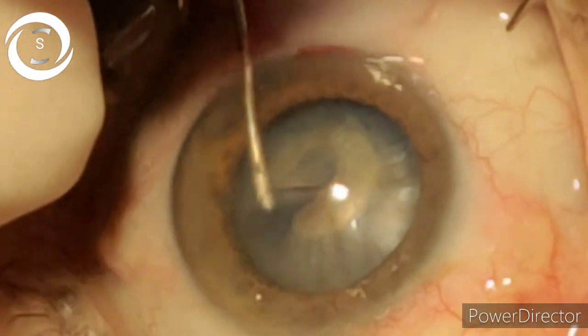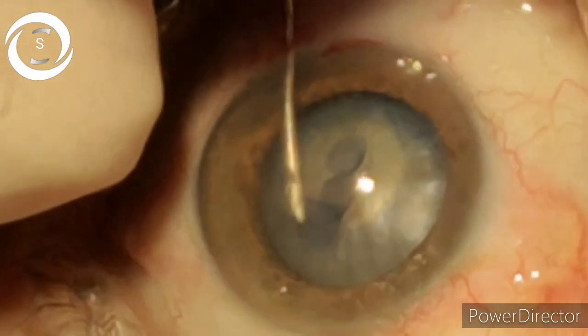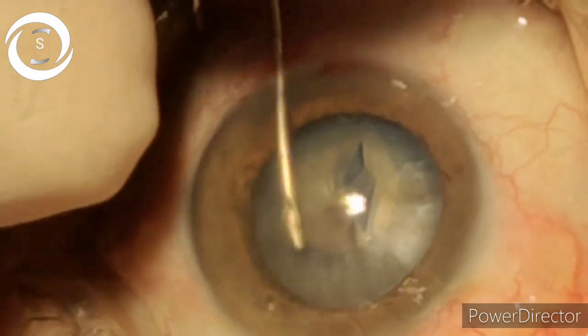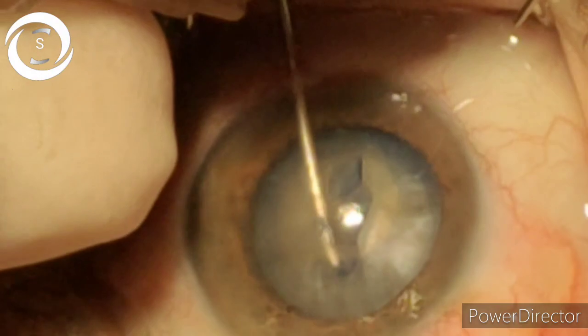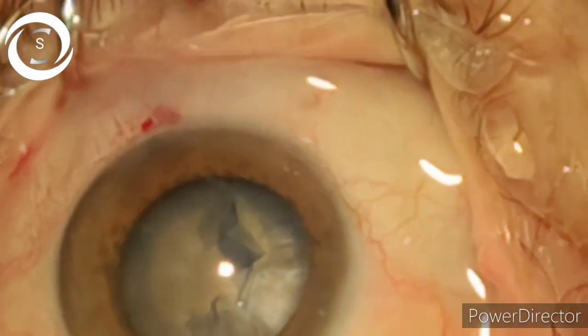If your rhexis is round, regular, and smooth, then whatever the type of cataract — whether it is a soft cataract, immature cataract, mature cataract, hypermature cataract, or cataracta nigra — you can emulsify it easily. You can see that I started as a small circle and now, just like a cochlear curve, I have enlarged the circle.